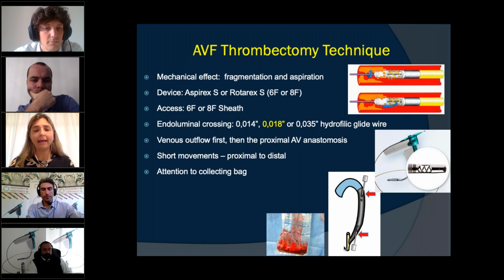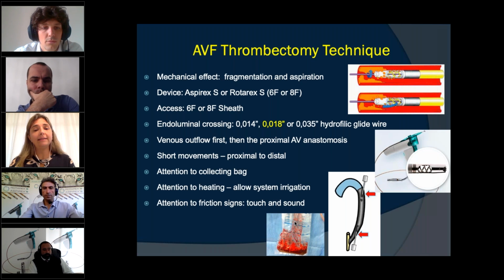Pay attention to the collecting bag, whether what's coming out of the device is clot, only blood, or nothing at all. Attention to the heating of the system. If it's too hot, take it out. Allow system irrigation because it may be obstructed by clot.